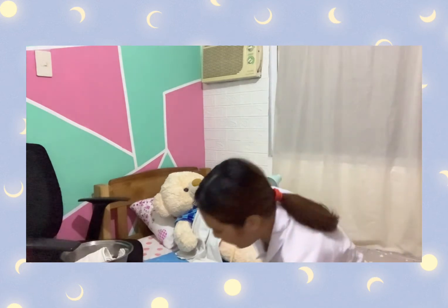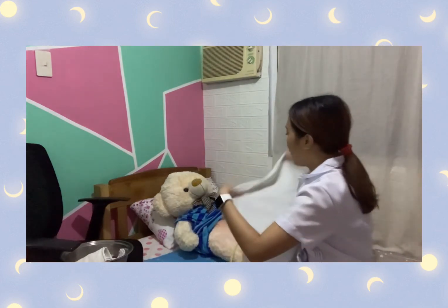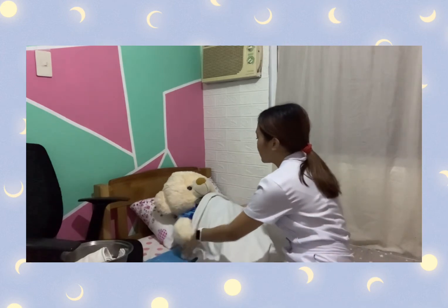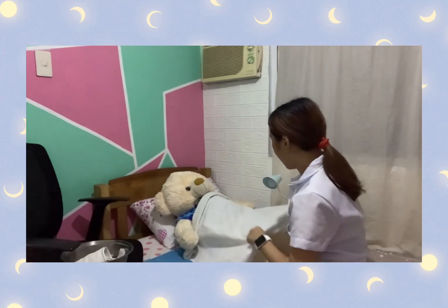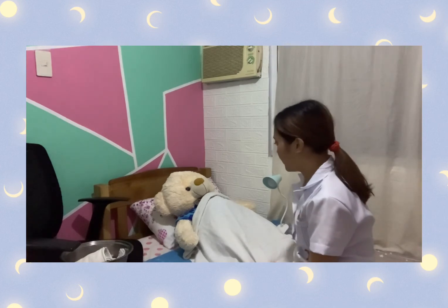We will return them to their proper placement, and then we will provide comfort to our patient by putting some cover on our patient. So, sir, are you comfortable in your position na po? Okay po, sir. After that, we will proceed on the aftercare for all of the equipment, and our patient is already comfortable. Now we can proceed on the documentation.